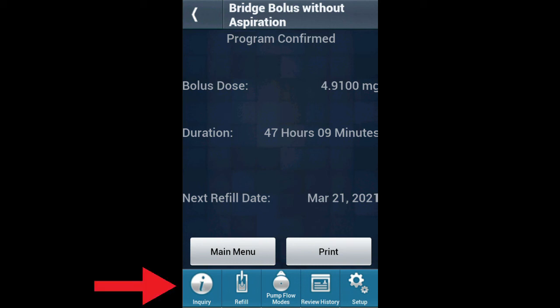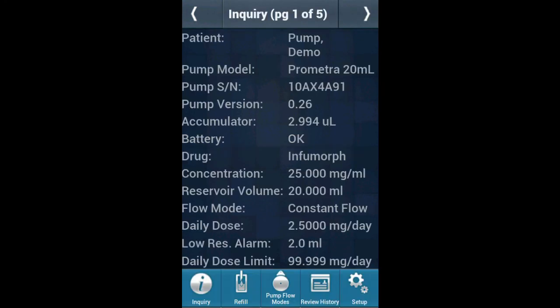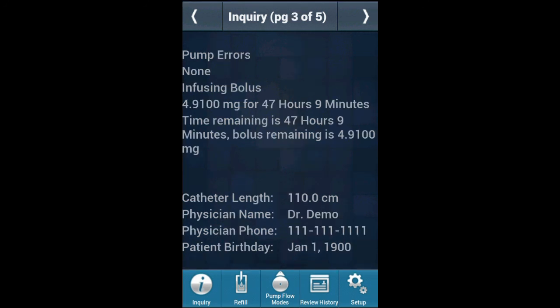To perform a final inquiry, click on Inquiry and place the programmer over the pump. Confirm the newly programmed settings. Also confirm that the bolus is infusing by scrolling to the third page using the arrow in the top right corner.